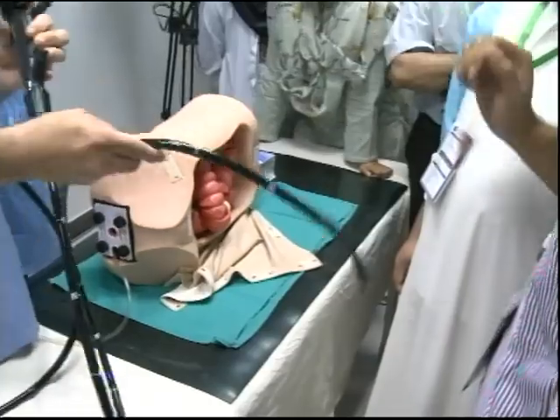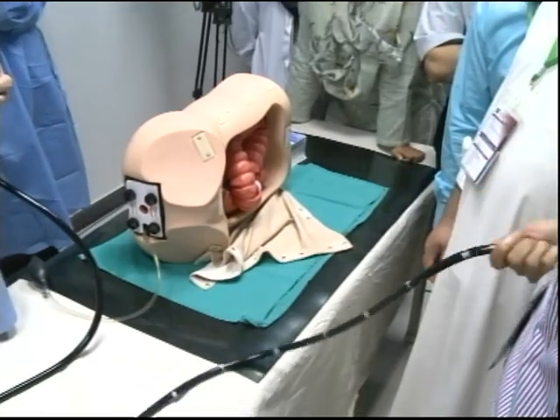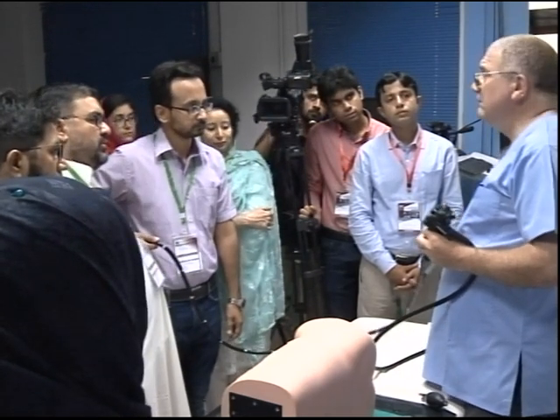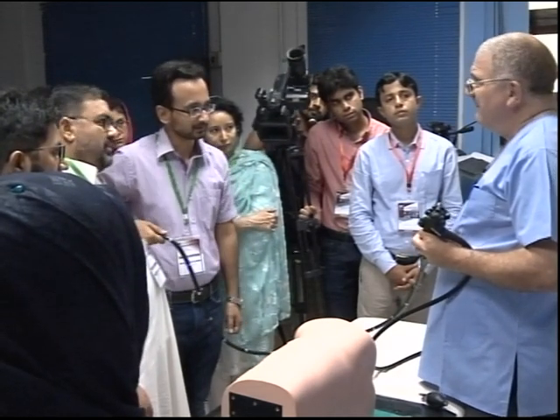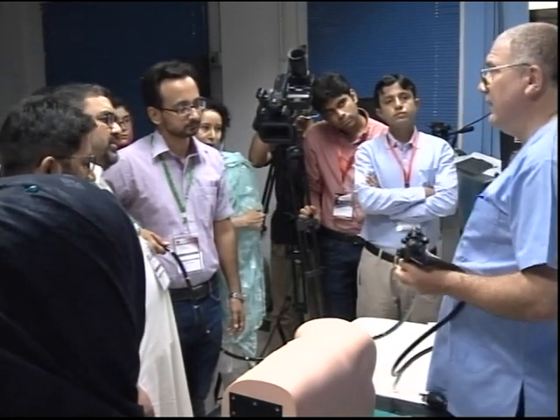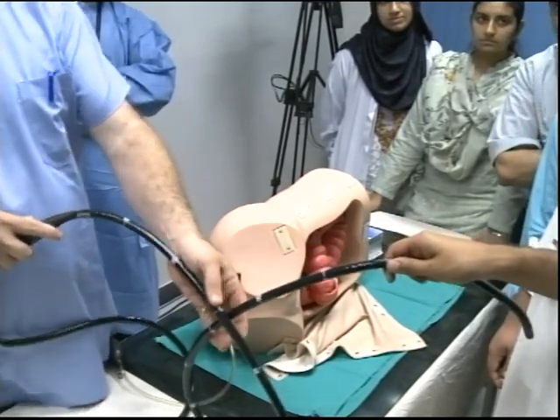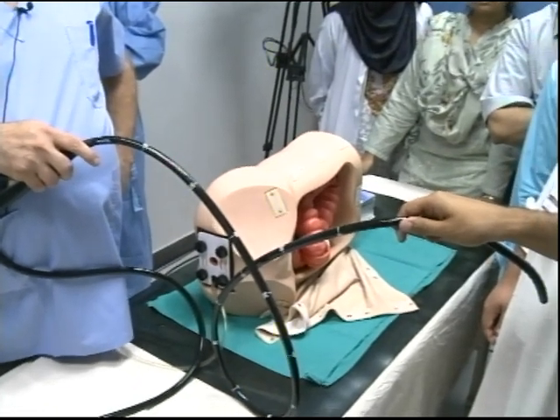Let's do it again. So reduce the loop. And then what would you do? Advance the scope. Go on then. Advance the scope, you said? Okay. So how many of you do what he's done? Stand there and do that. Okay. Now, let's do it again. Now, close your eyes. Osama's not going to let you hit anything. Slowly take the loop out and walk backwards.